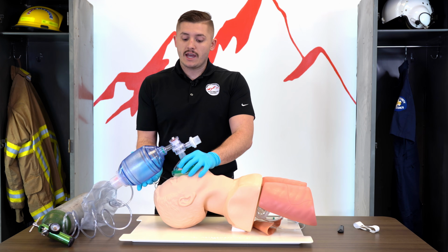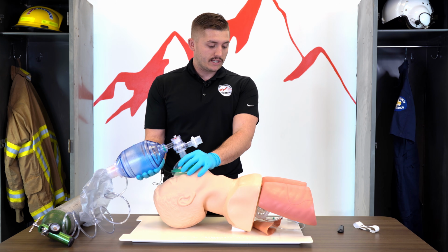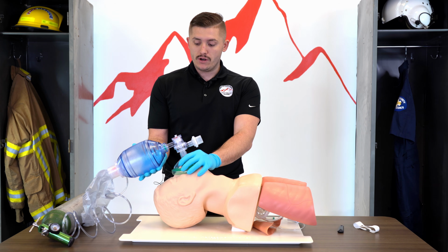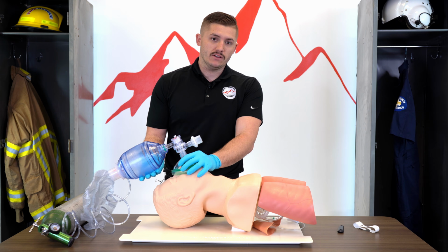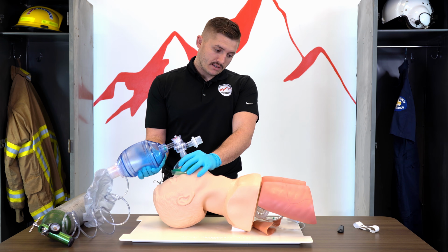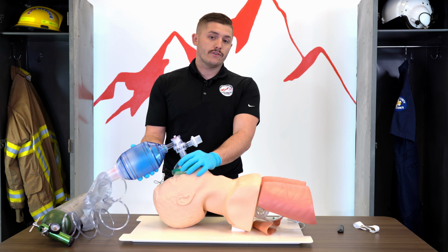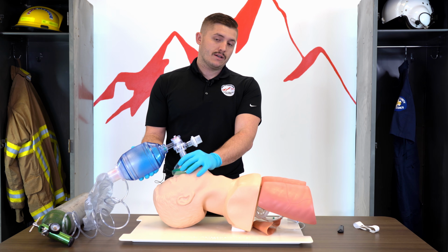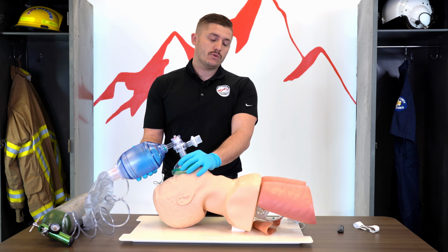Right, so I slow down, I take some deep breaths myself before I give some deep breaths to my patient. I'm going to look at their chest. And as soon as that chest rises, I know I no longer need to continue to squeeze the bag and overinflate their lungs. See that chest rise? I might hold it for a second. So when delivering a breath, you're going to deliver a breath over a full second. So 1,000. And we typically give one breath every 5 to 6 seconds for 10 to 12 breaths per minute.